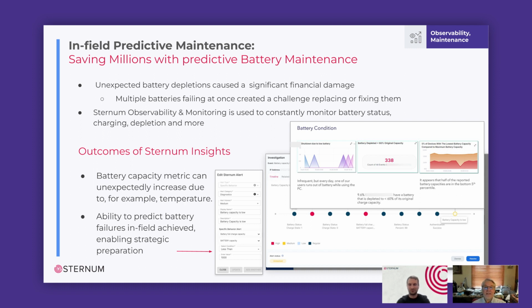And one of the questions we hadn't thought of to implement in our traces was what's the discharge rate over time. We have multiple different ways of using this instrument, using different wireless connections to other devices, and each one of those has a different profile on how rapidly it burns down the battery, but we don't have a good idea on what that is. And so one of the things that we're doing on our next iteration of the firmware is to actually measure during different use cases what the battery capacity is at the beginning and the end of that use case, so we can measure over time what the depletion rate was, and now have a basis for knowing if it's used in this way, this is how fast it's going to use up the battery. And then in turn, we can use that for product design to size the battery capacity appropriately.